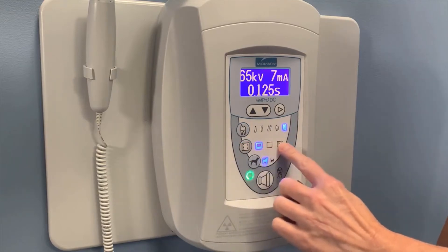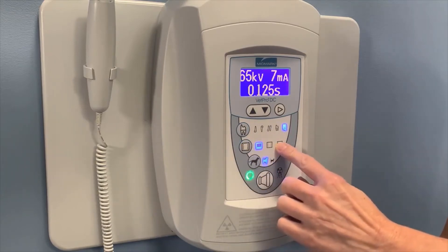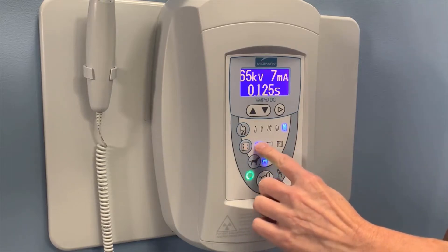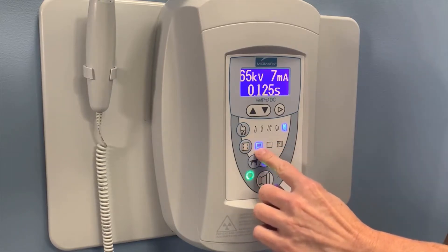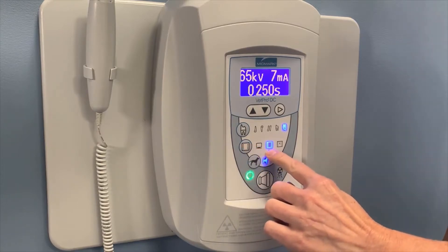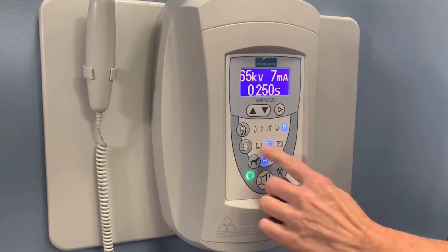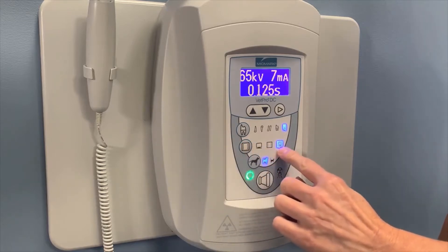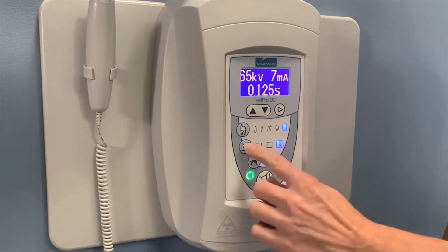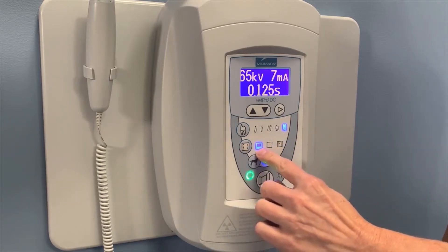There are three options for receptors. First is going to be the digital sensor — it has a little computer on it. The second is regular speed film. And then third is going to be the CR or phosphor plate technology. Let's put it back to the digital sensor.